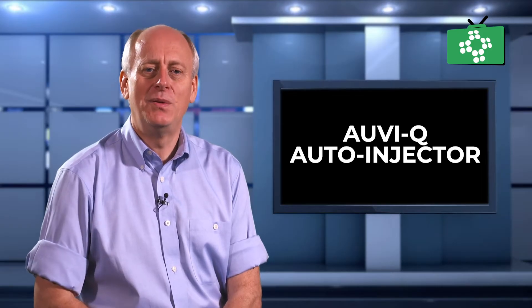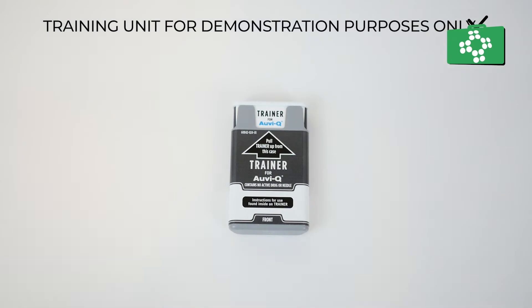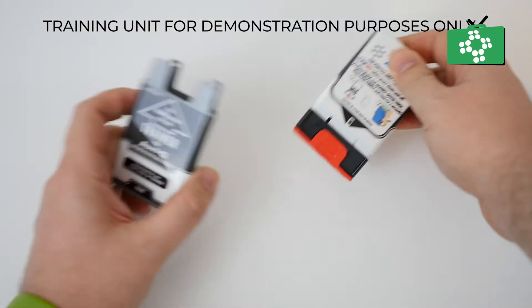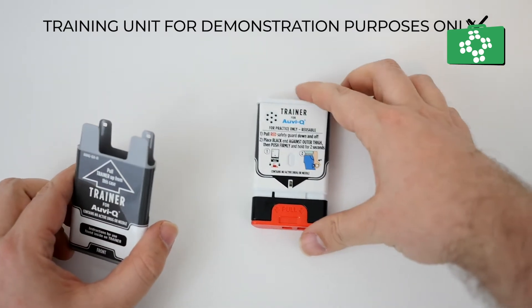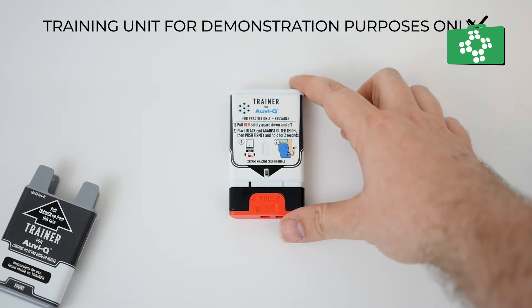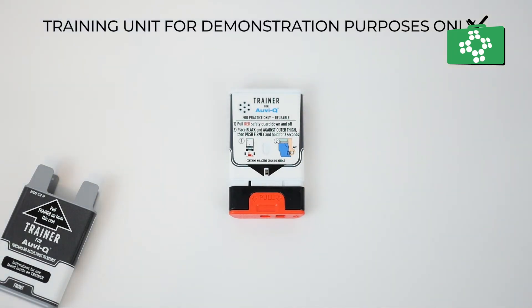There are three types of AUVI-Q autoinjector. The first one, which is white and purple, has 0.1 mg of epinephrine and is for infants and toddlers weighing between 16.5 to 33 pounds. The next step up is for children weighing 33 to 66 pounds and contains 0.15 mg of the drug, and has a blue casing.